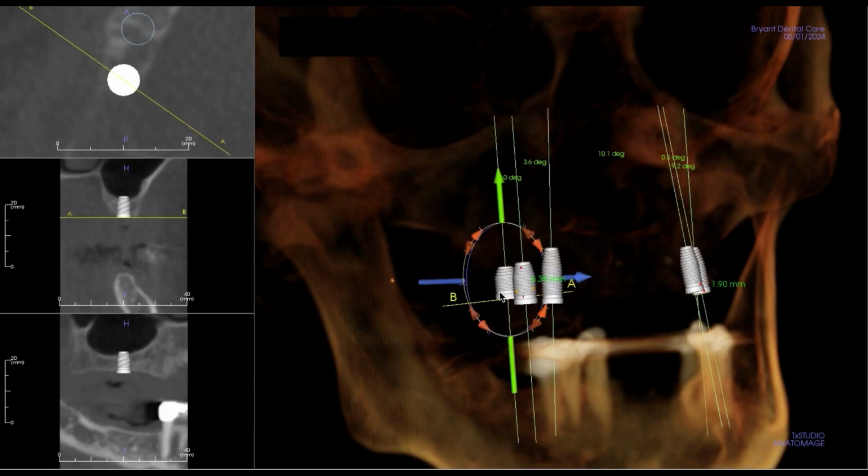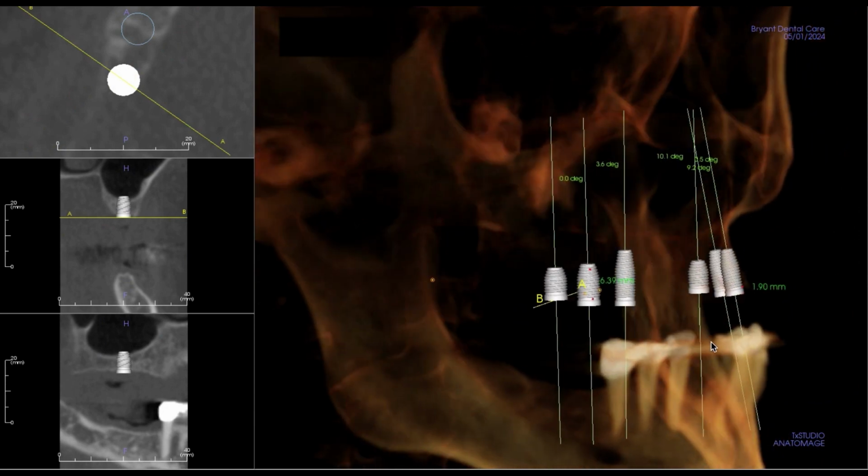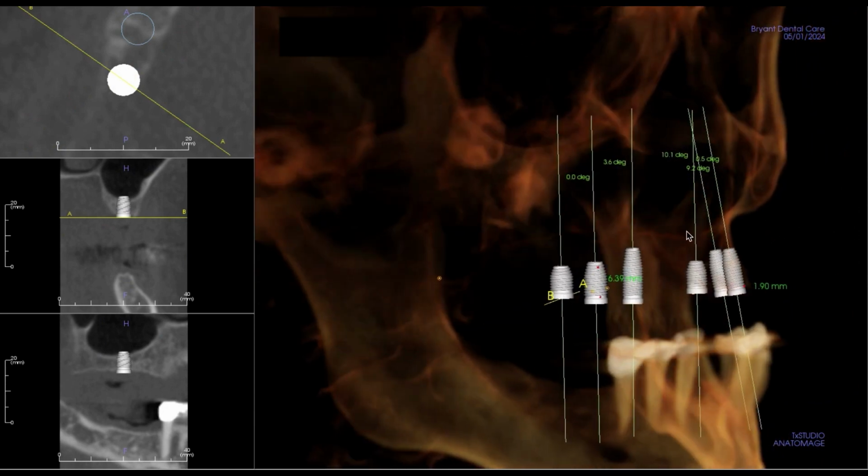Let's start with the implant sizes. I placed them pretty much where I thought they should go. The anterior bone is rather protruded, which is not great for an overdenture. So we're going to try to put these implants where we can have them most axially aligned. We'll call these 3, 4, and 5.